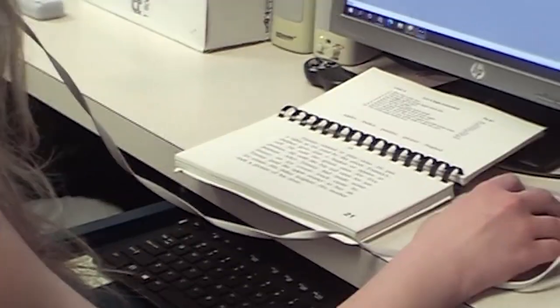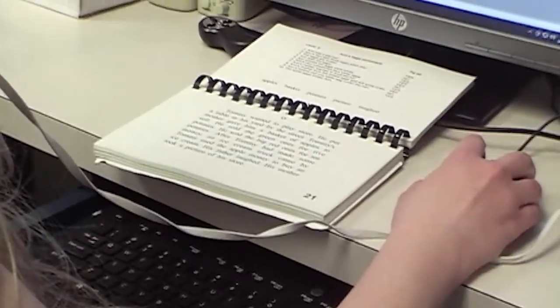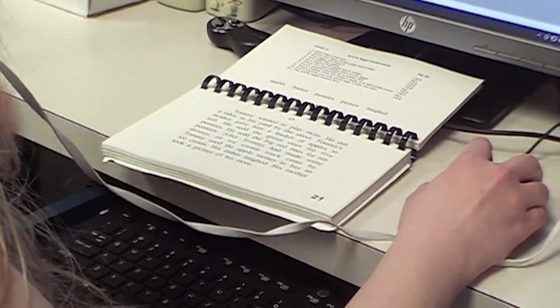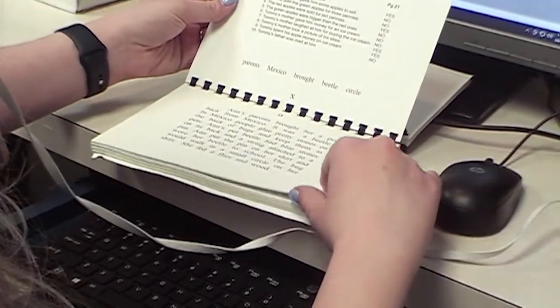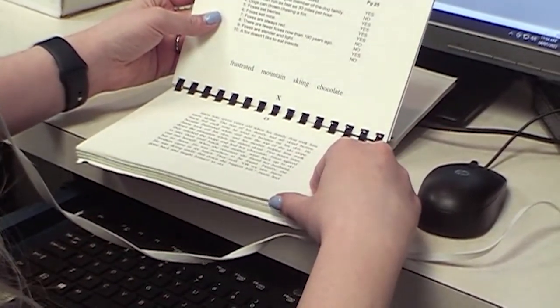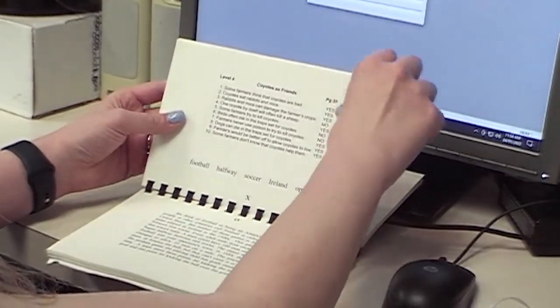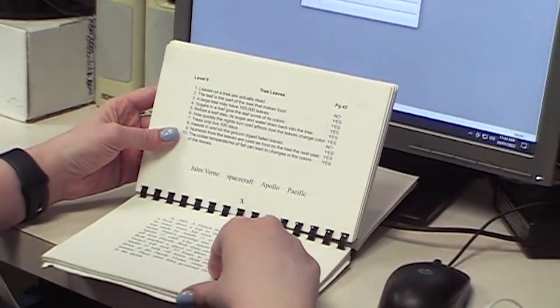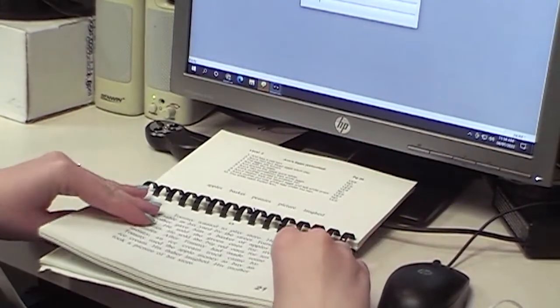You can see the reading passage here is for somebody who's relatively young. If you would flip over so that the viewer can see the older ones. And here you can see that the reading material is becoming much more complex. On the top part, you can see those are the questions, the yes or no questions that somebody's asked. Obviously, they're not seeing the answers to those questions.